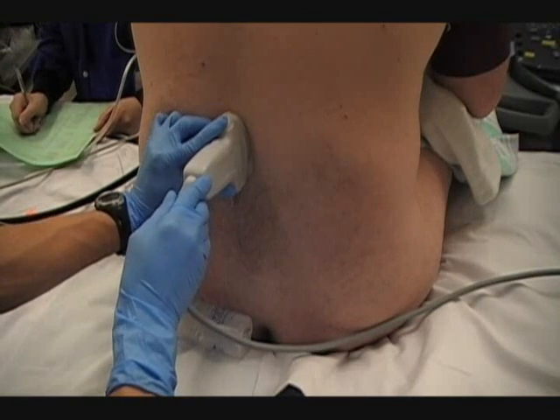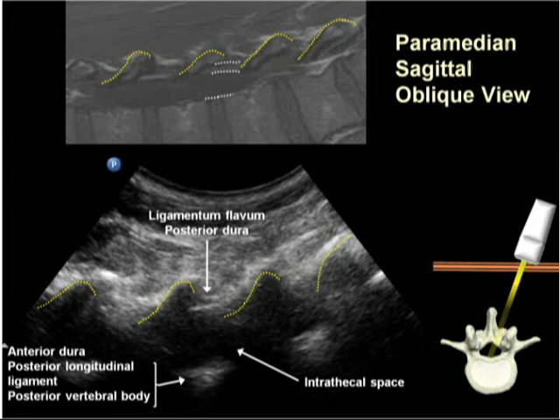On ultrasound, the sloping lamina have a sawtooth-like appearance. In between the saw teeth of the lamina, the limits of the vertebral canal are visible through the paramedian interlaminar spaces as two horizontal hyperechoic linear structures. The deeper structure is the anterior complex and represents the posterior aspect of the vertebral body, the posterior longitudinal ligament and anterior dura. Above that lies the hypoechoic intrathecal space containing cerebrospinal fluid, and superficial to that the posterior complex comprising the posterior dura, epidural space and ligamentum flavum.